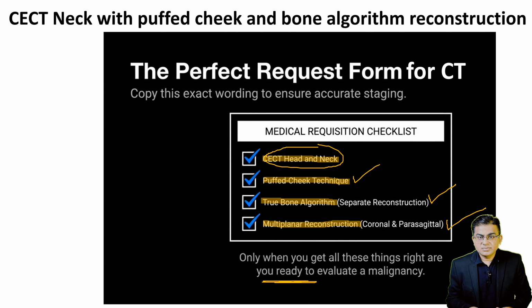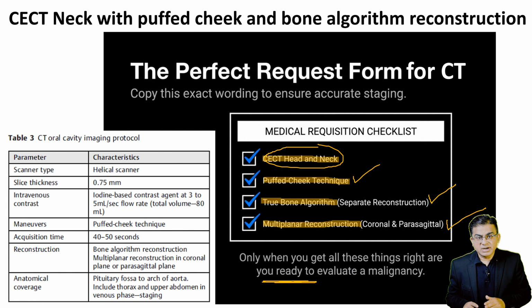In some specialized centers, this protocol is incorporated in their routine work, but not in many other centers. This is an ideal CT protocol you must follow in your radiology department for any patient with oral cancer. I hope I made it absolutely clear to you how to acquire an ideal CT scan for head and neck malignancy. These are some important things oncologists are not taught, so I thought I should teach you at the beginning of your career in oncology.